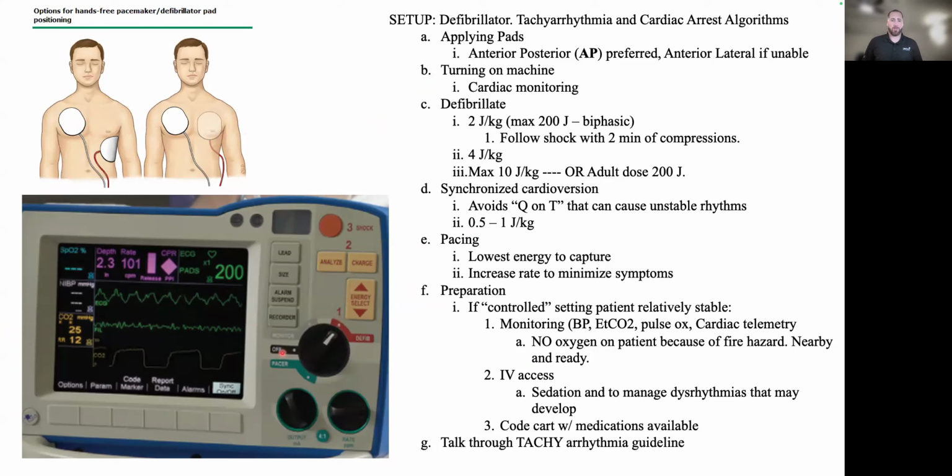Here, the off position is turned here. You can just turn it on as a monitor, or this red is a defibrillator, and green is pacing. Turn it to whichever one you want to use. In this case, we're using it as a defibrillator. So one, two, this asks you if you want to analyze or charge. If you know that you're wanting to charge it, you would select your energy and charge, and then you would say, I'm clear, you're clear, we're all clear, and you would defibrillate the patient.